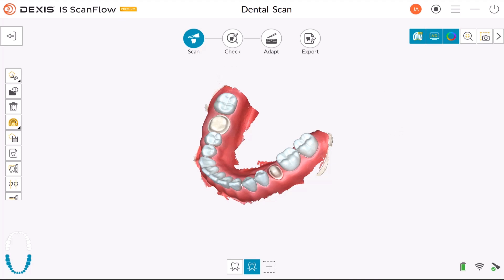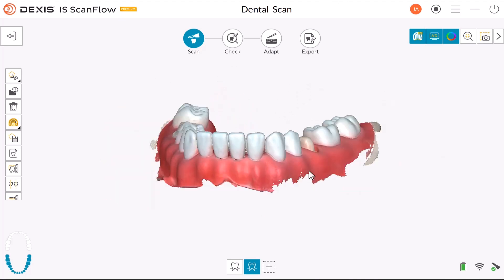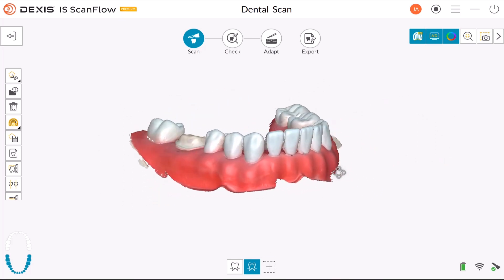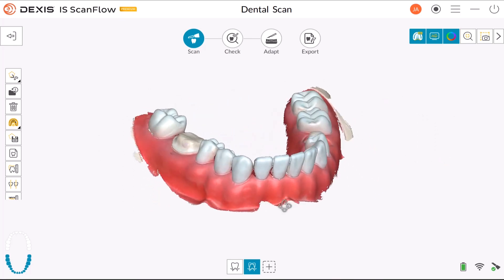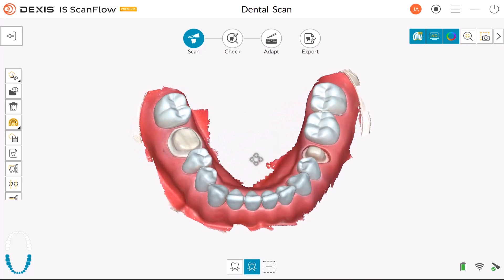You can use several tools to closely examine the 3D model and verify undercut, occlusion, and distances between points in the mouth, as well as adjust the bite. To refine the 3D model and further examine it, follow these steps.